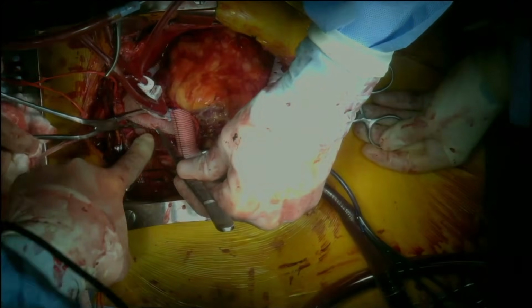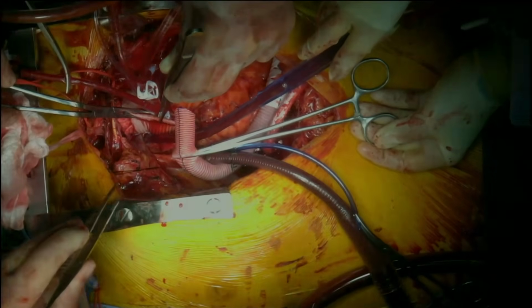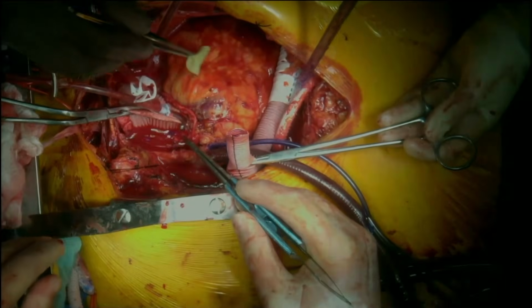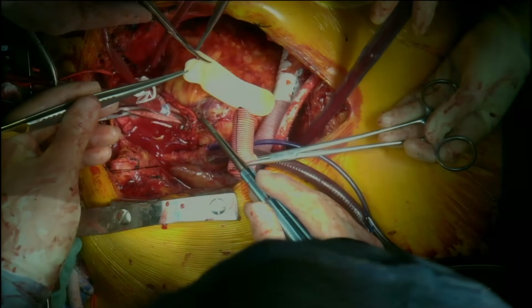A partial occlusion clamp is applied to the conduit. The LVAD outflow graft is anastomosed to the conduit with reinforcement using a pericardial patch.